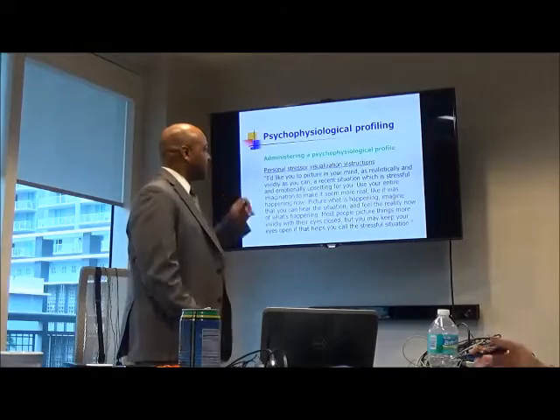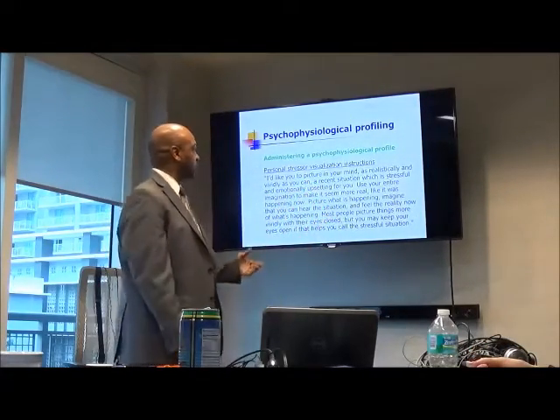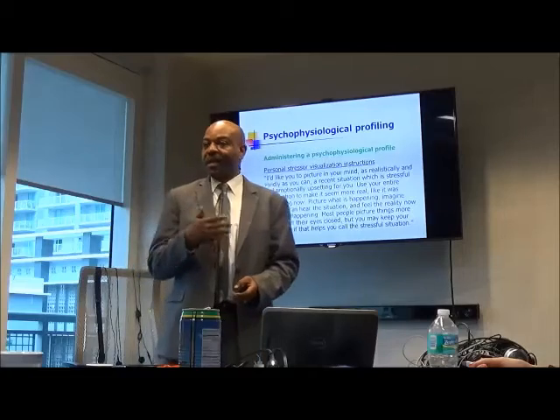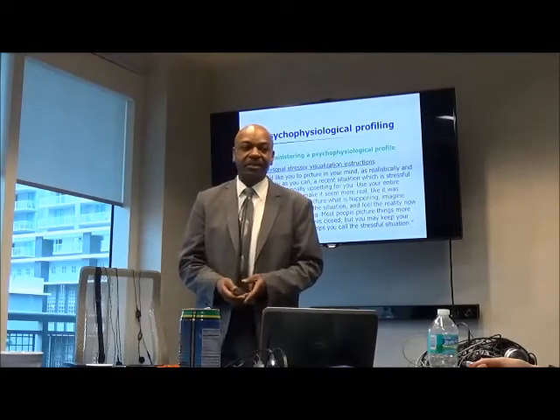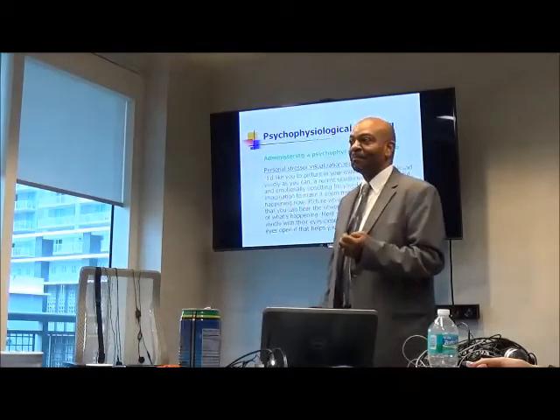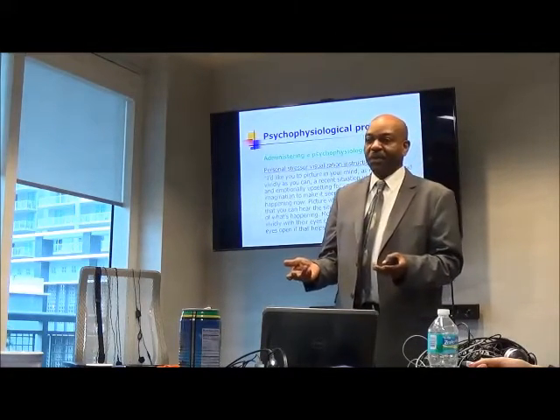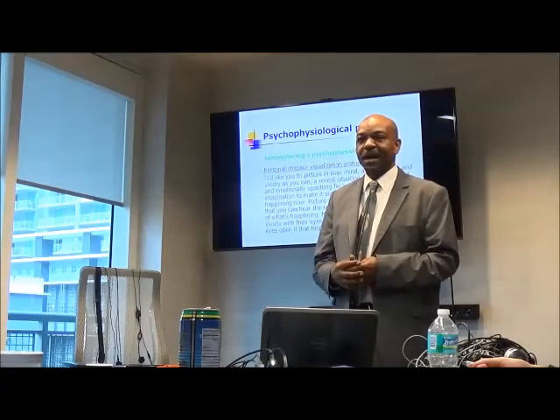Yeah. Okay, so we talked about explaining to the person about how to do the thinking or talking about a stressful situation. And again, I said I tell them to actually talk about it because I don't believe all the time that they're going to think about it the whole time. The other thing is when you do tell them to talk about it, often they will say something very short and stop.